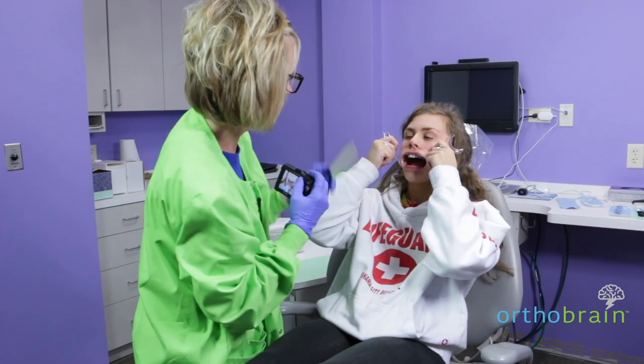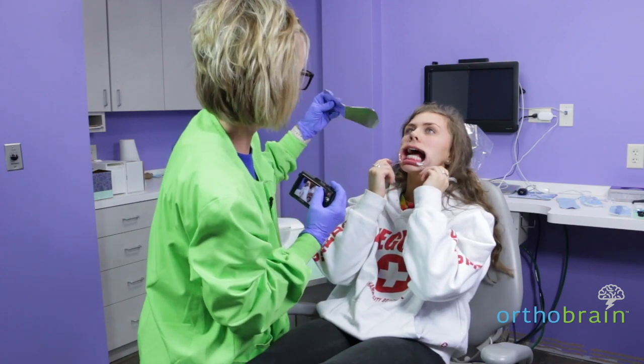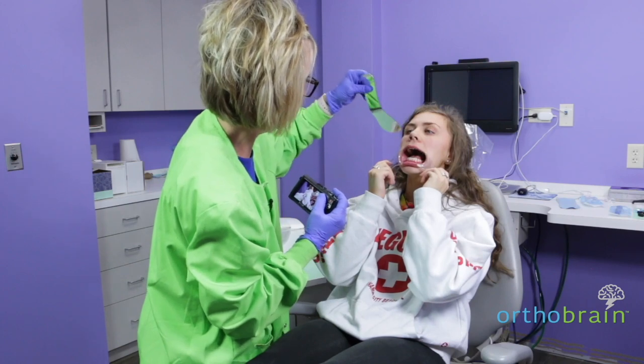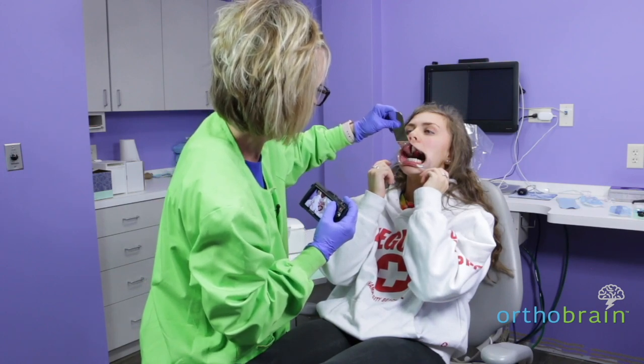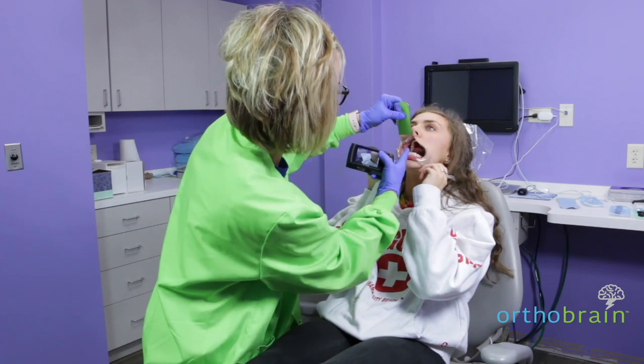Now we're going to do it the opposite way. Pull those down and tip your head back again. I'm going to flip the mirror over. Tip your head way back. You can see the first molars.